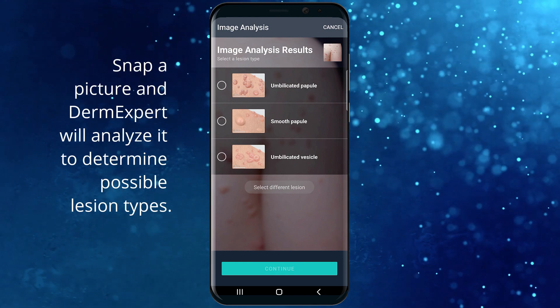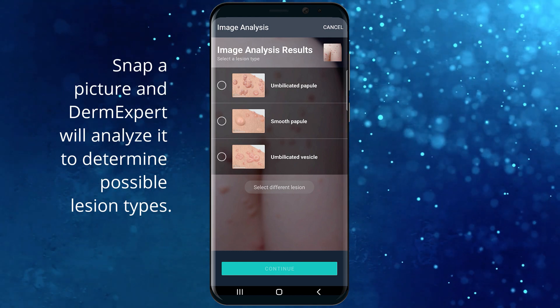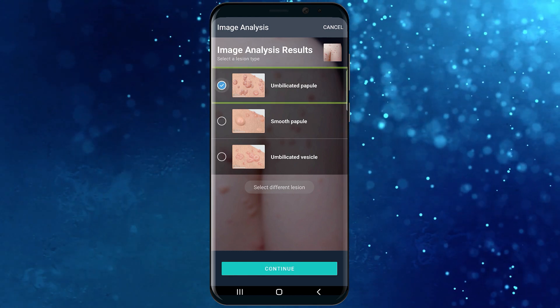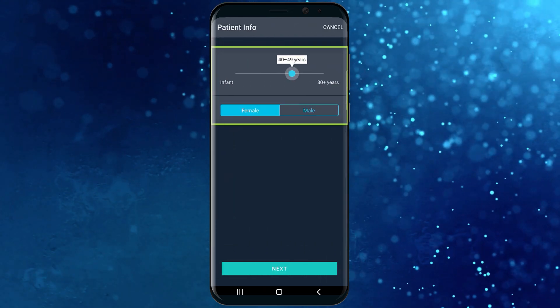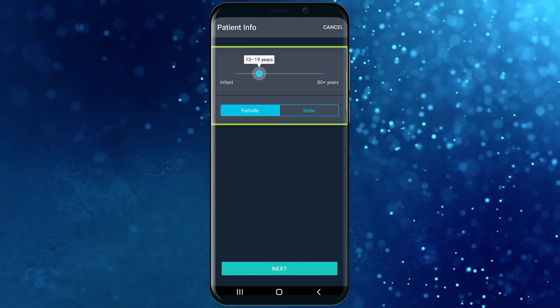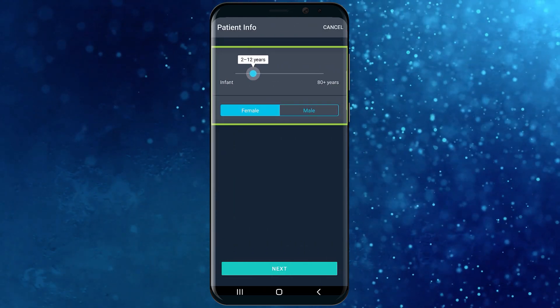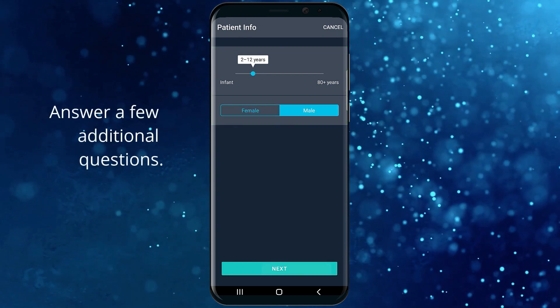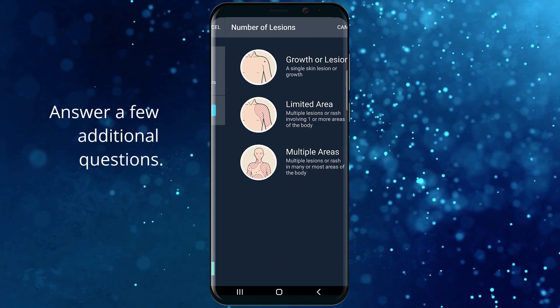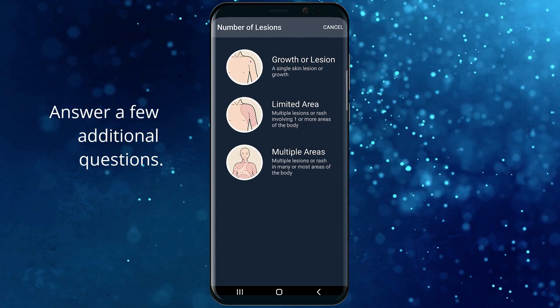Choose the correct type — in this situation, umbilicated papule. Adjust the patient information, then answer the workup questions as they appear in sequence.